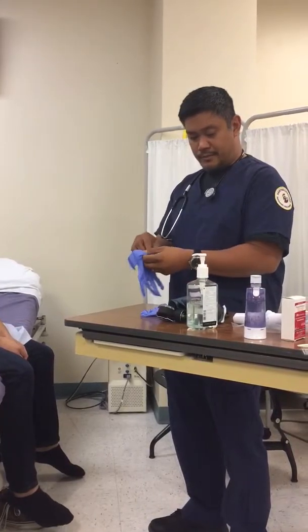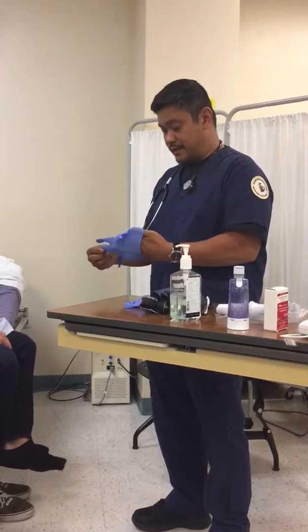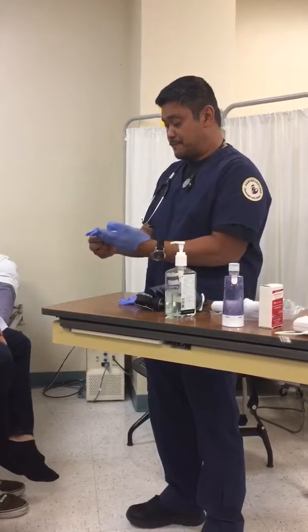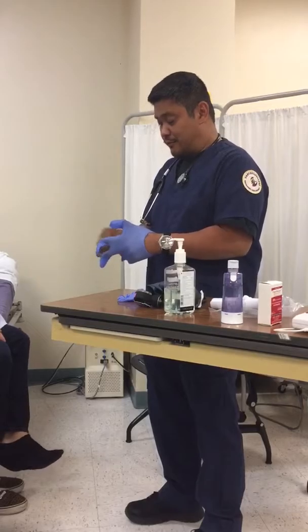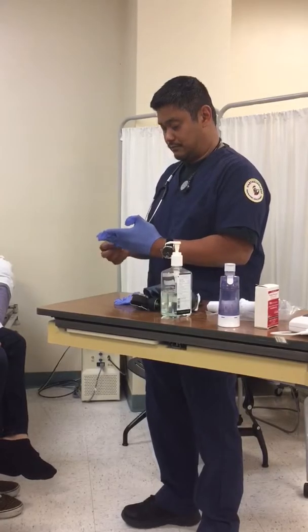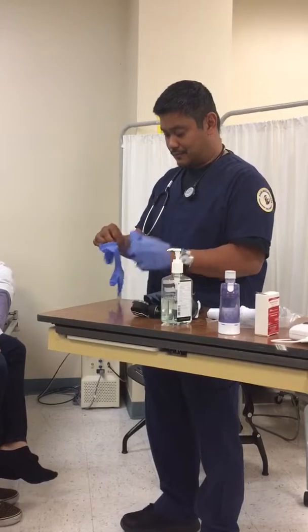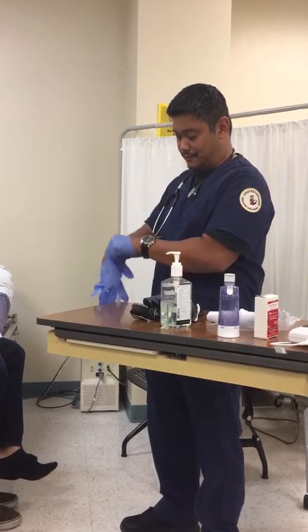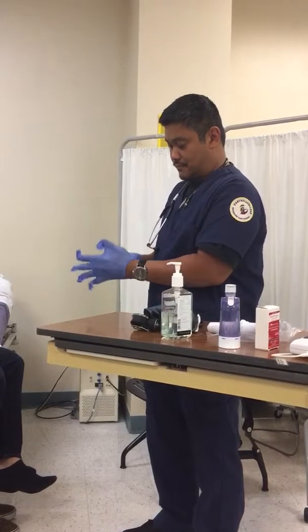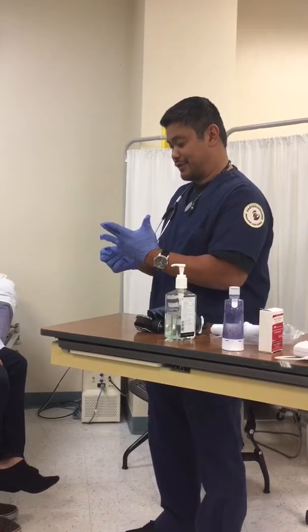So as I mentioned before, we'll be doing an instruction on MDI. And before we do, we'll be taking your vitals today, and we'll be doing it twice. One before and then one after. Thanks for waiting for me on that. Sometimes these gloves are a little tricky.